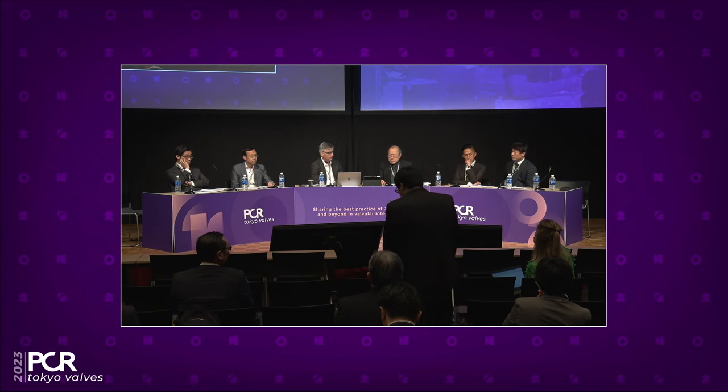Again, what is your key message about the difference between these two platforms, Dr. Seitz? Because I know you also have a lot of experience with both. Yes, but I think for Navitor, we don't need any strong effort. But for Evolut, sometimes we need some strong spirit to decide whether the position is nice or not.